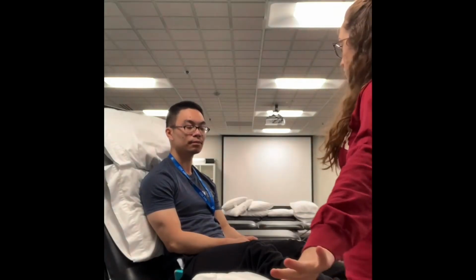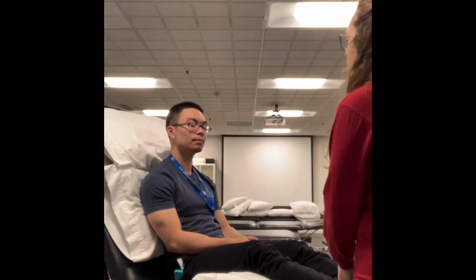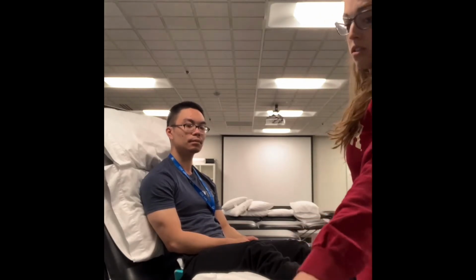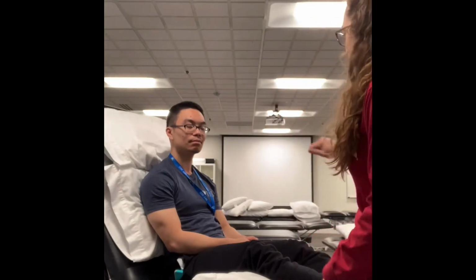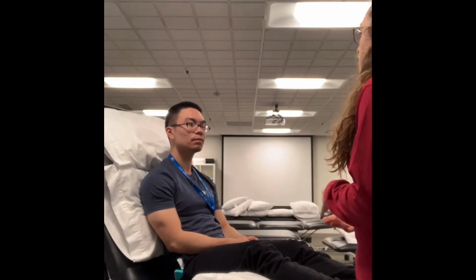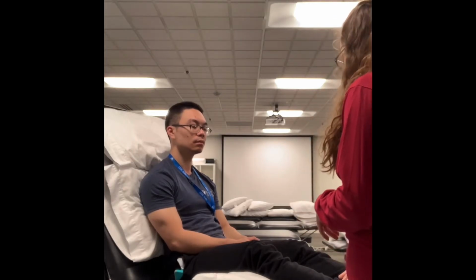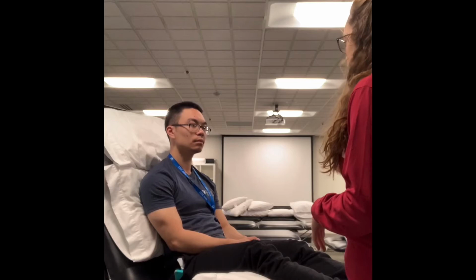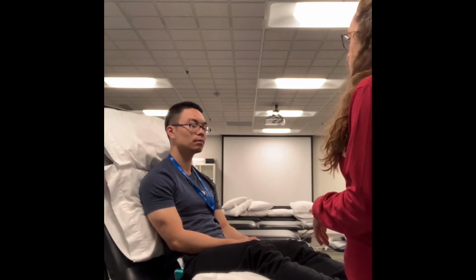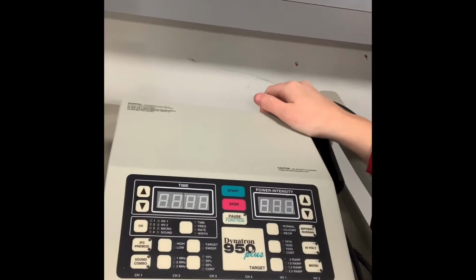So it's this machine right here, and what I'm going to do, over the inflammation on your ankle, is just use this little wand and put some gel on it, and then we'll go over the inflamed area. We're going to do this because it increases blood flow to the area that is inflamed, and also because it's supposed to help with tissue healing and bone healing. Okay. Does that sound okay to you? Yeah. Okay. So we're going to turn the machine on.